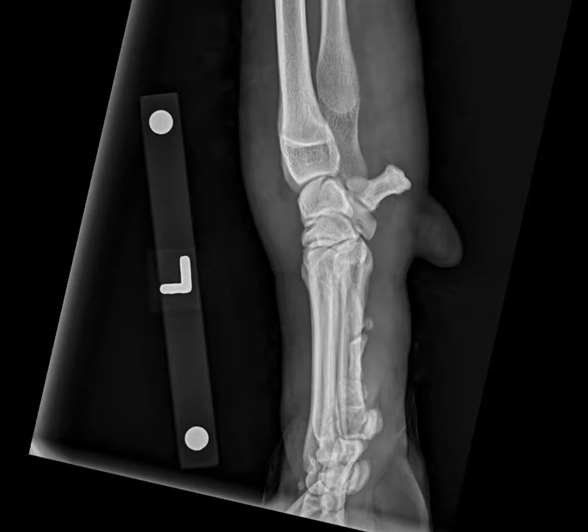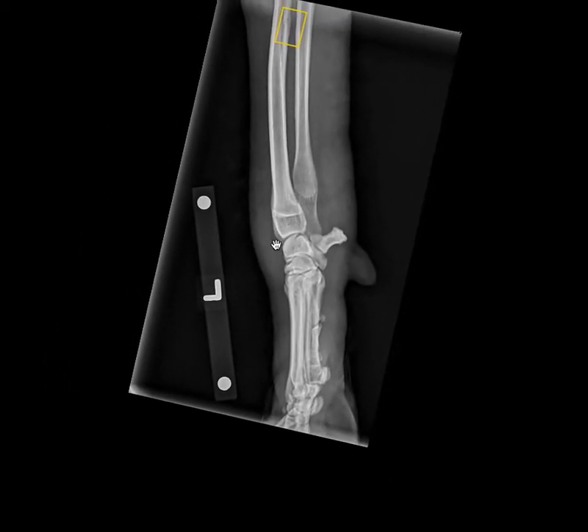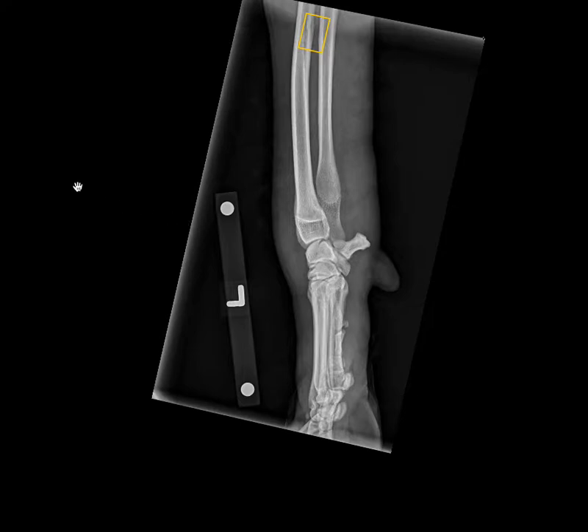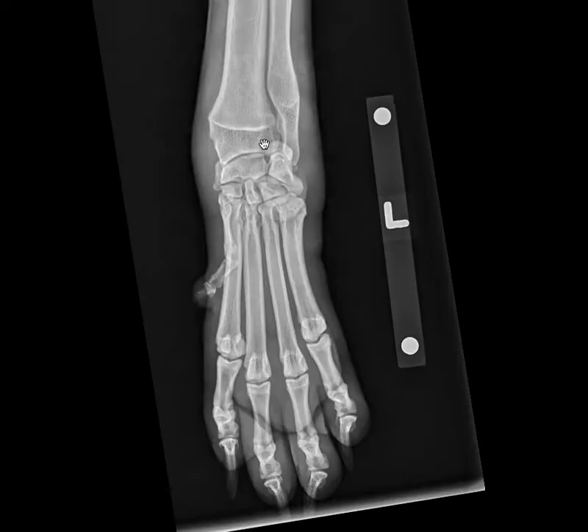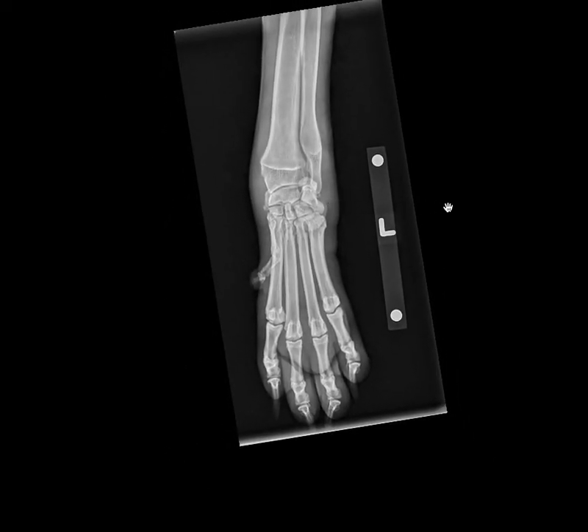Let's start with A for alignment. We actually did radiograph quite a bit of the limb in this case, so I'm zooming out so you can have a look. I've placed a yellow rectangle on the nutrient foramen so that we don't get distracted — this is normal remodeling at the level of the nutrient foramen in the intraosseous region of the radius and ulna. My overall impression is that the alignment of the limb on the lateral view is appropriate, and moving to the DP view, the alignment looks fairly appropriate there as well.